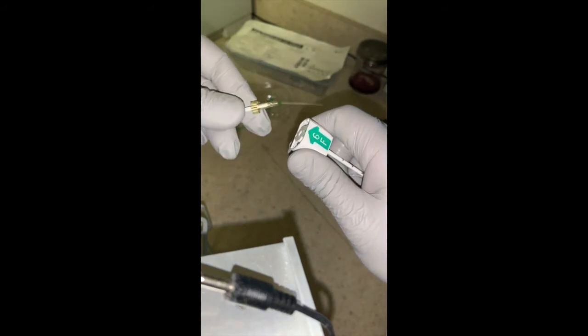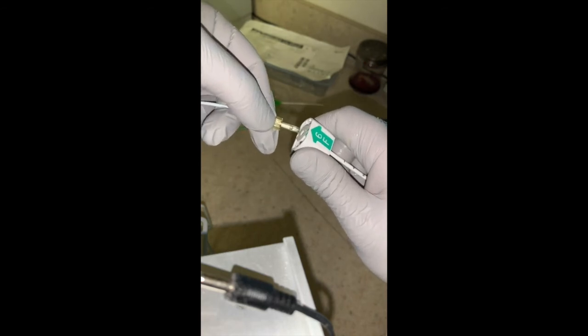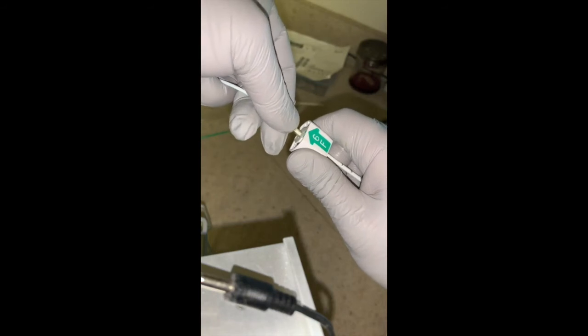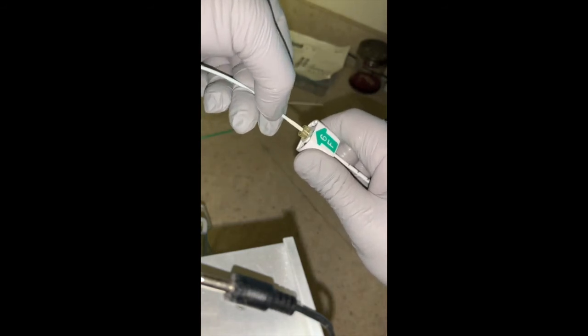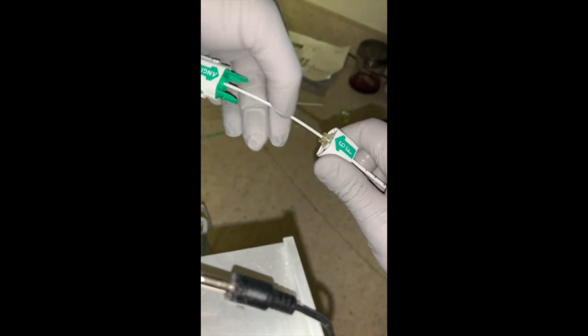Ready to insert the little collagen plug. You have to hold it from the tip because otherwise it may buckle or break. While holding again very firmly on this side, you clip that in, and then in small bites start to advance your Angiaseal device in.